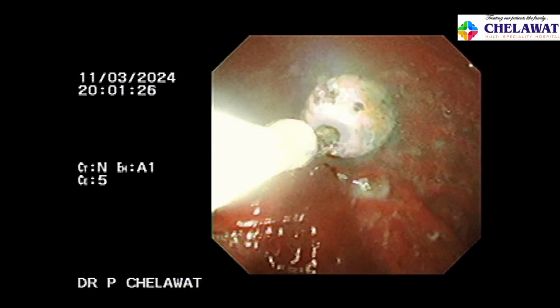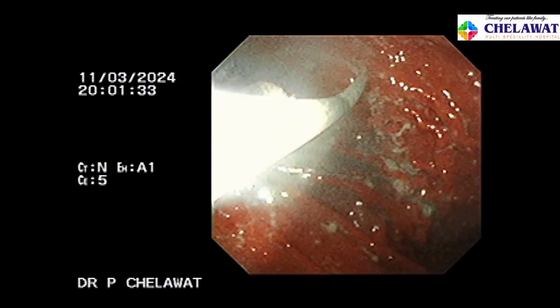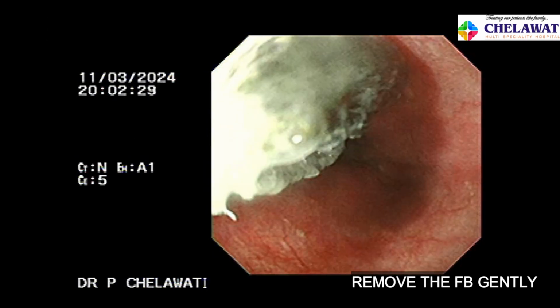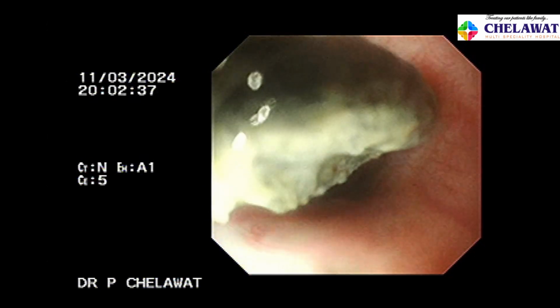Once the battery is in the stomach, you can deploy the Roth net as there is a lot of room, and then remove it very gradually. The complications of this procedure can be tracheoesophageal fistula and chest complications like mediastinitis.